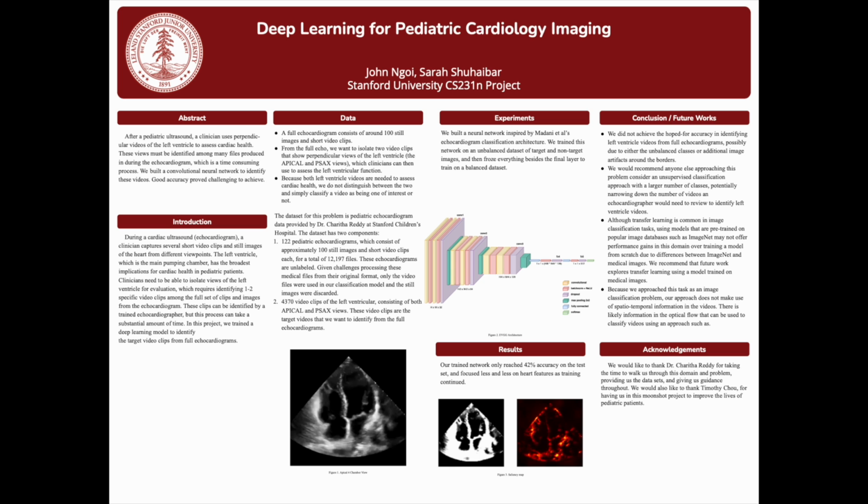After a pediatric ultrasound, a clinician uses perpendicular videos of the left ventricle to assess cardiac health. These views must be identified among many files produced during the echocardiogram, which is time-consuming. We built a convolutional neural network to identify these videos. Achieving good accuracy proved to be challenging.